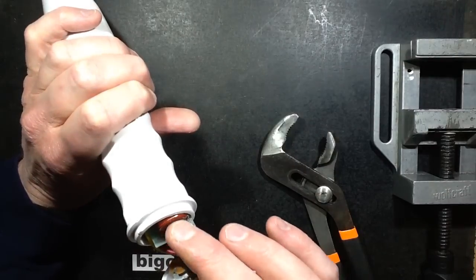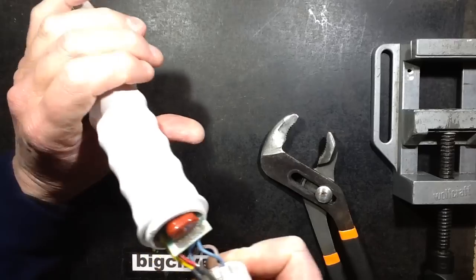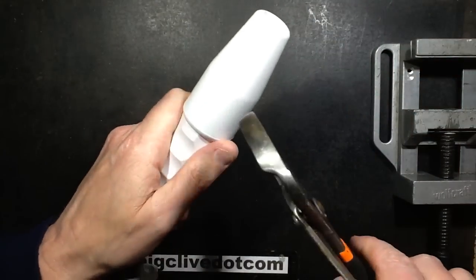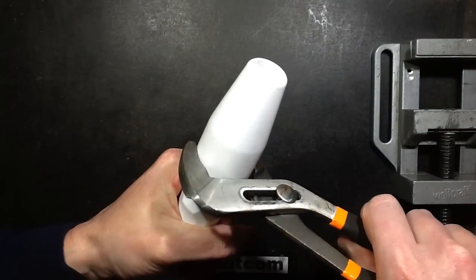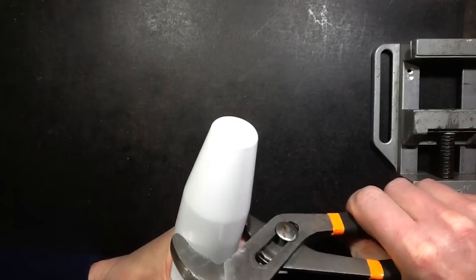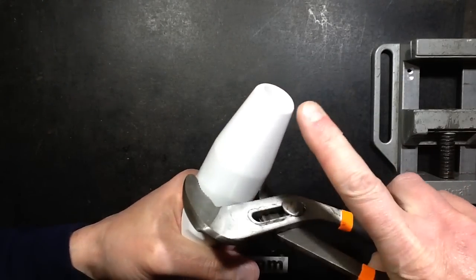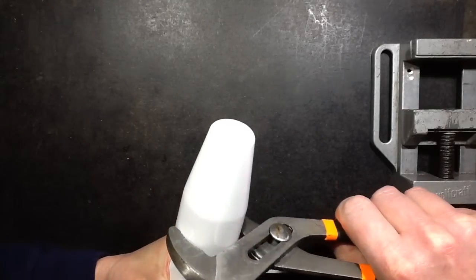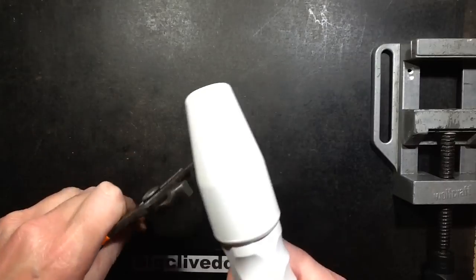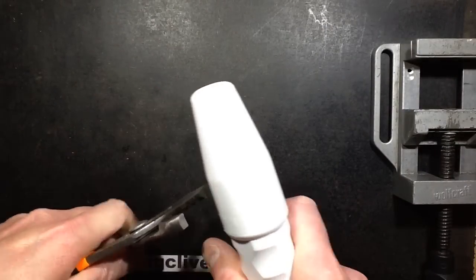I'm guessing this capacitor here is probably going to be 2.2 microfarad because I did a test on this unit. I did a test from the output here to the plug pins, and it was showing a capacitance value of about 2.2 microfarads. I'm not sure how much else was in the circuit that would have been affecting that.